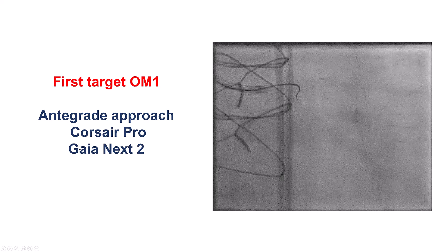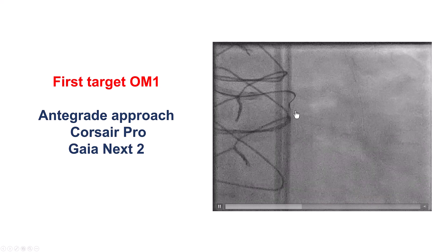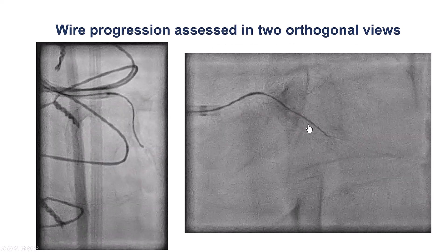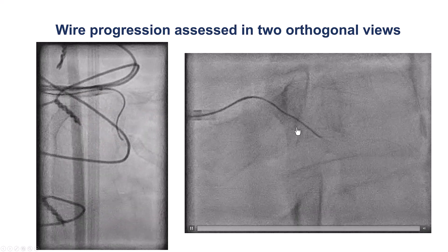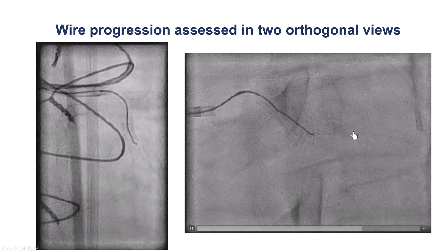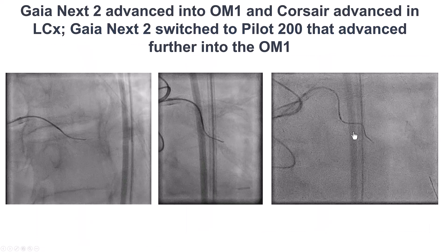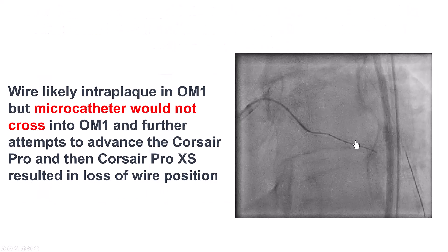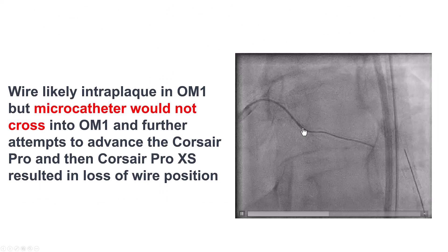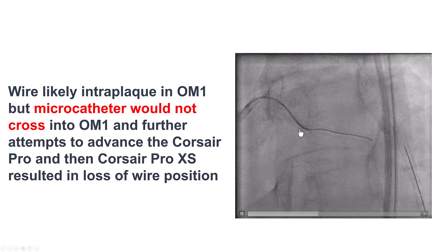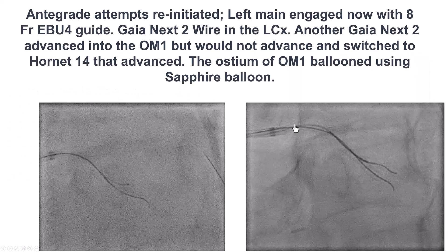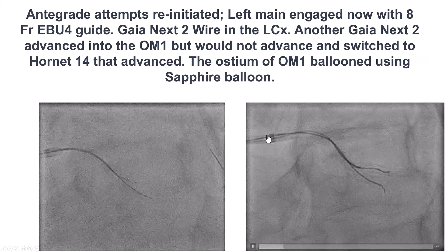We tried to cross antegrade using a Corsair and Gaia Nex 2, making some progress along the course of the previous stent and moving into the obtuse marginal stent. We switched to a polymer-jacketed wire that advanced a little further, but then had difficulty advancing the microcatheter through the first stent into the obtuse marginal stent. Eventually, during attempts to advance, we lost both the wire and guide position, so we started again.